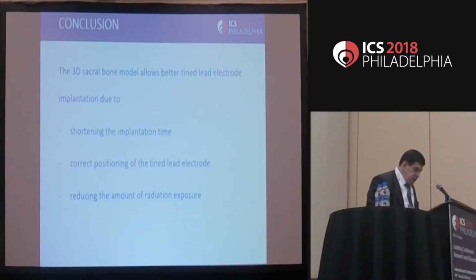In our conclusion, the 3D sacral bone model allows shortening the implantation time and correct positioning of the tine lead electrode. A very important point is to reduce the amount of radiation exposure to the patient and to the physician. Thank you for your attention.